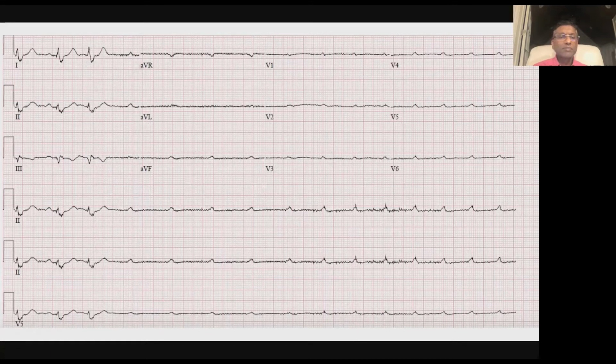The rhythm in 1, 2, and 3 is not very regular. I mean, the interval between the QRS complexes. Okay, you're talking about the left side of the screen here? Left side of the screen. Okay. In the lead at the bottom, it starts off as irregular with morphology changes. Okay. Then what do you think is happening over here?